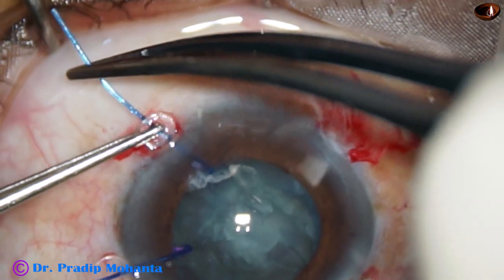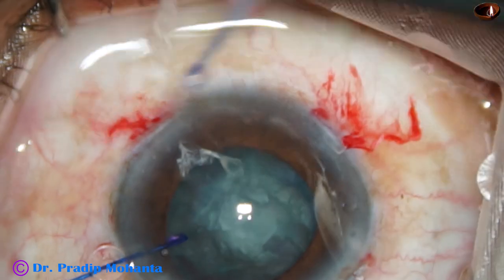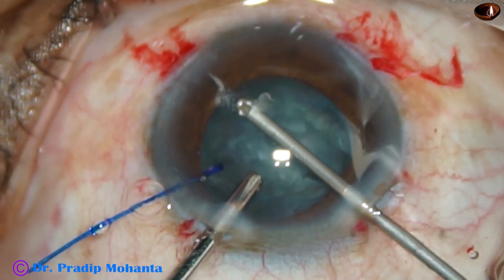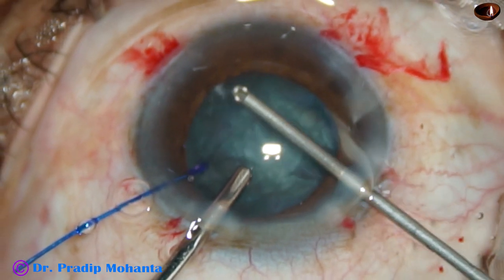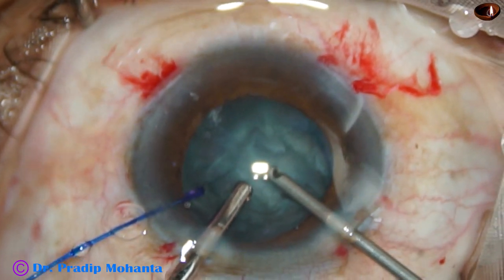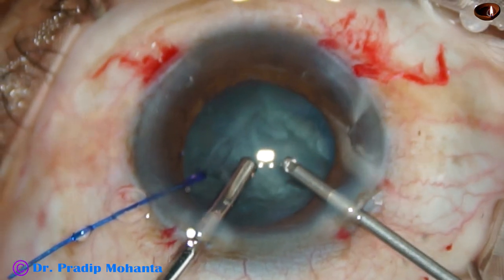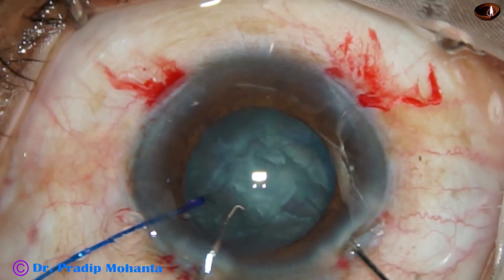I inject some viscoelastic. To remove that vitreous nicely, I remove the iris hook temporarily — we have to reapply it whenever necessary. Then I use the cutter and remove this vitreous strand. Since we used triamcinolone, the vitreous is stained, and whenever it prolapses into the anterior chamber we can easily identify the prolapsed strands. The vitreous has been nicely trimmed.